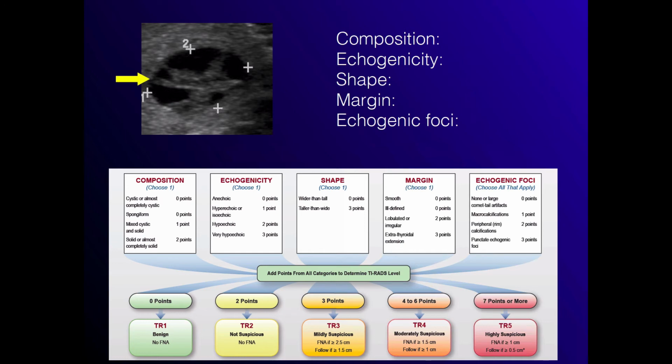So you don't report things that aren't getting followed up. I wouldn't recommend reporting it. We don't say that you can't report it, but why report something that you're not going to do anything about? Especially if you're using a system that is potentially going to take you more time for each nodule, since you're going to look at things beyond just size.